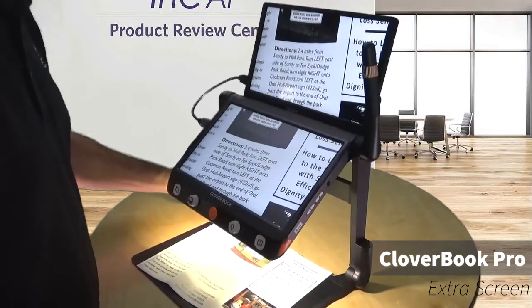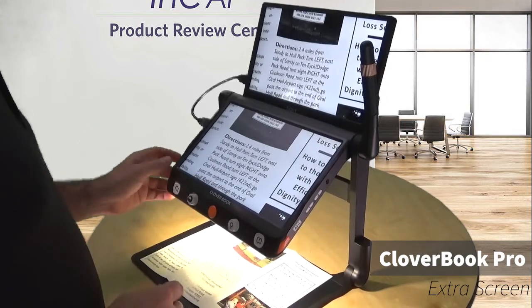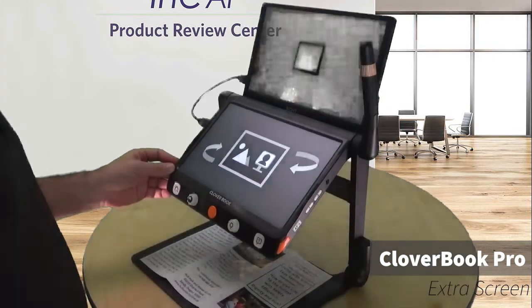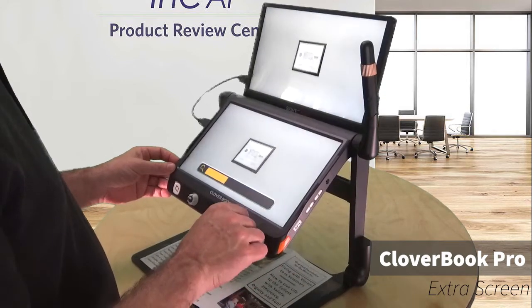And that's initially going to duplicate my screen. But then I can use the button that I use for my split screen to do all kinds of fun things now. I'll hit this, and now I have a distance view shown on both screens. I can zoom in on that.